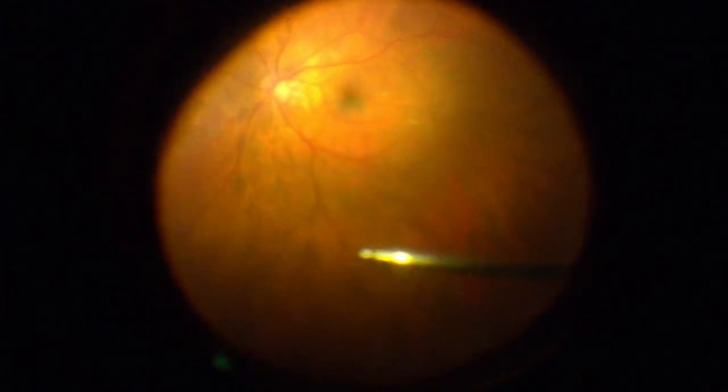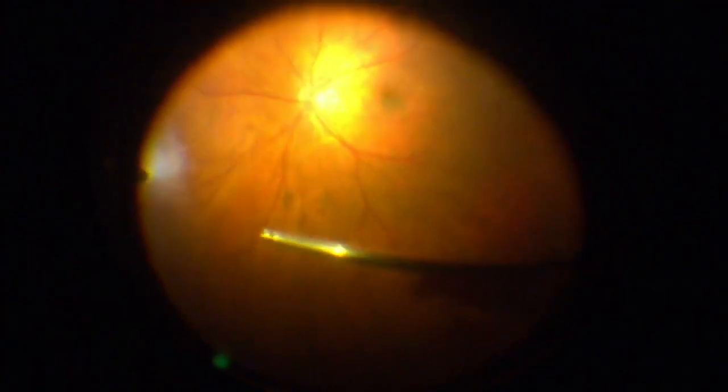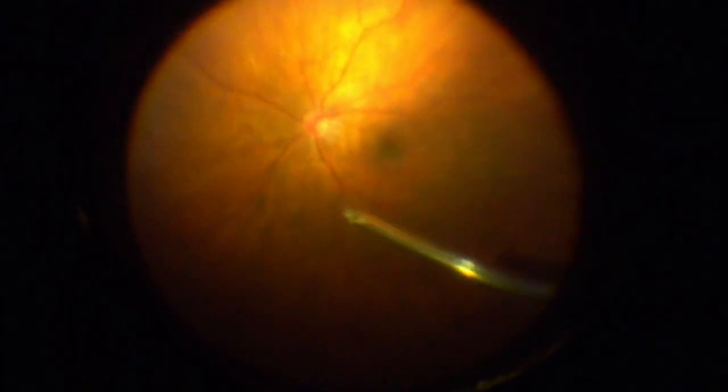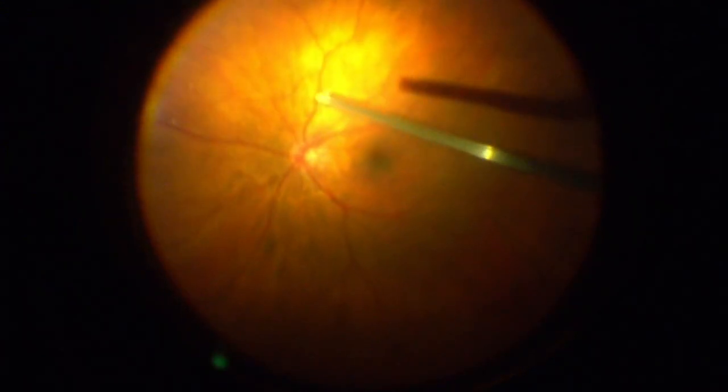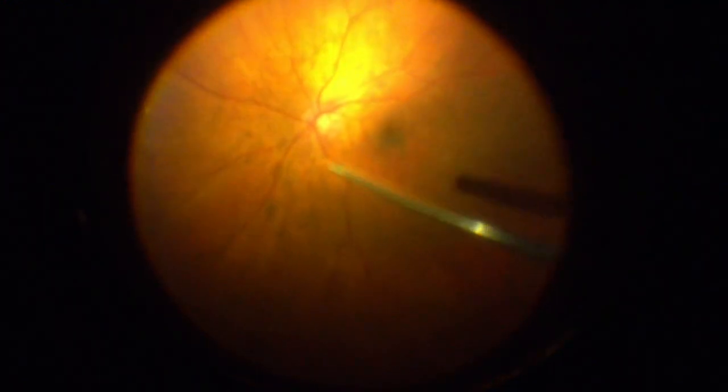I always start temporally with whichever hand's temporal, but if you're really right-handed dominant, I have partners and know many colleagues who just always use the one hand, even in doing vitrectomy. It's a little easier for some maneuvers if you can use the left hand on occasion. We're going to switch hands here and take away a little more vitreous.